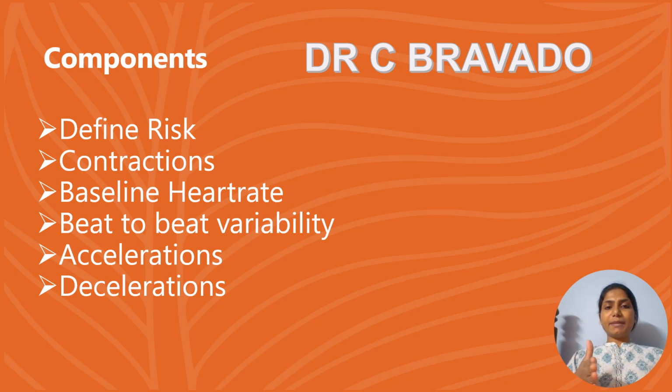I will explain a little about why the CTG has evolved. Usually by 28 to 32 weeks of gestation, the fetal autonomic nervous system gets more matured. That's why before this period of gestation, the CTG will not be a better predictor for asphyxia or acidosis. After 32 weeks, the autonomic nervous system is very mature. So there is a constant interaction between the sympathetic nervous system and the parasympathetic nervous system.